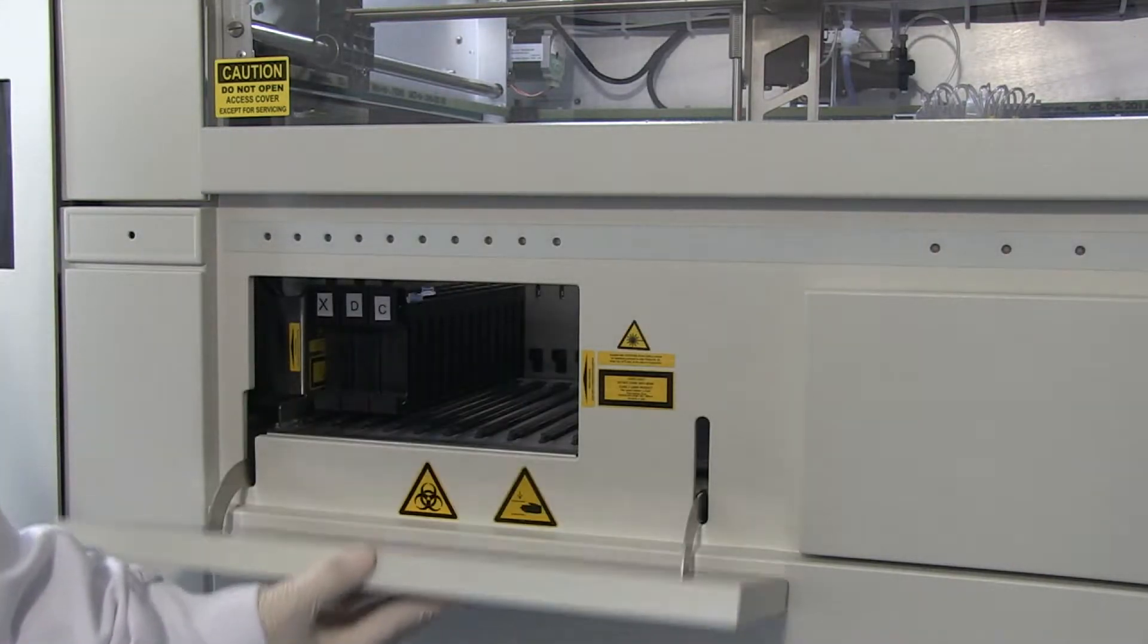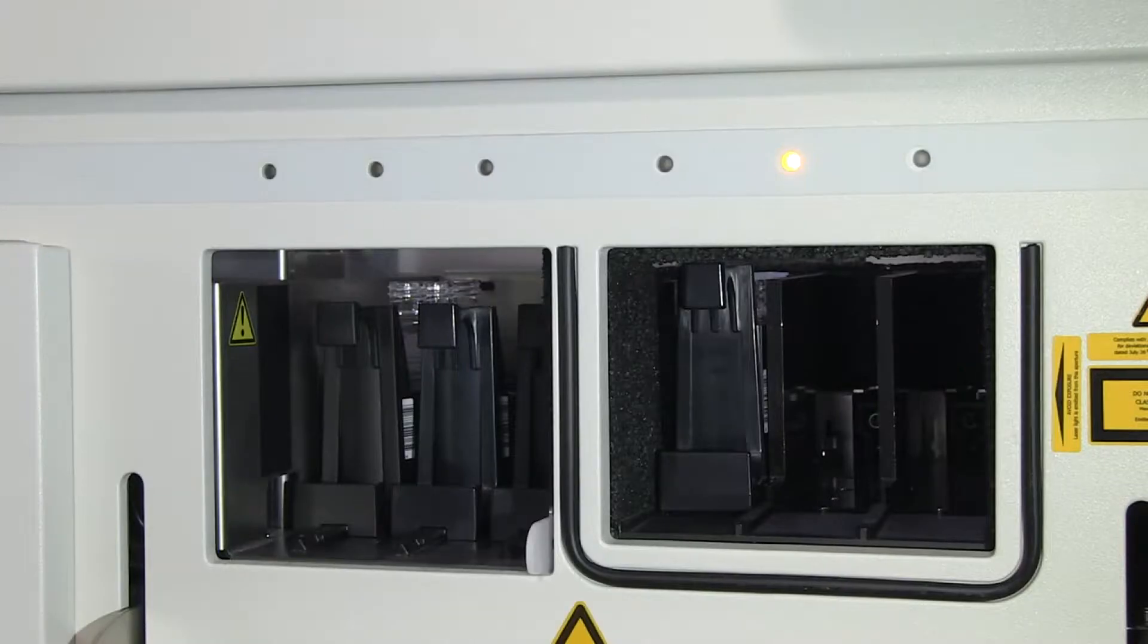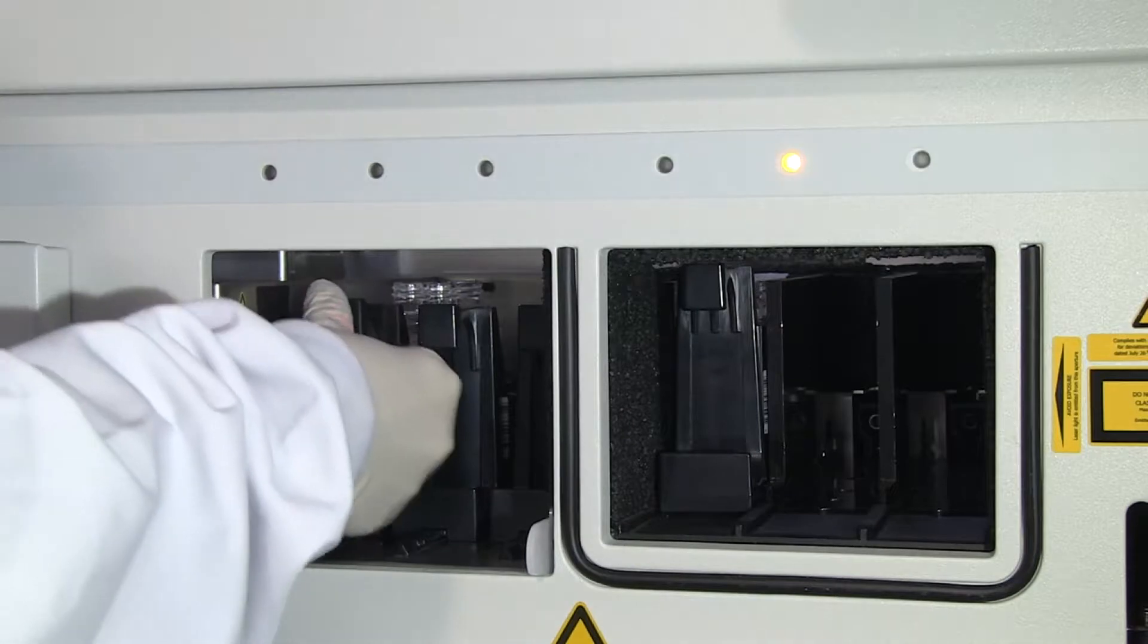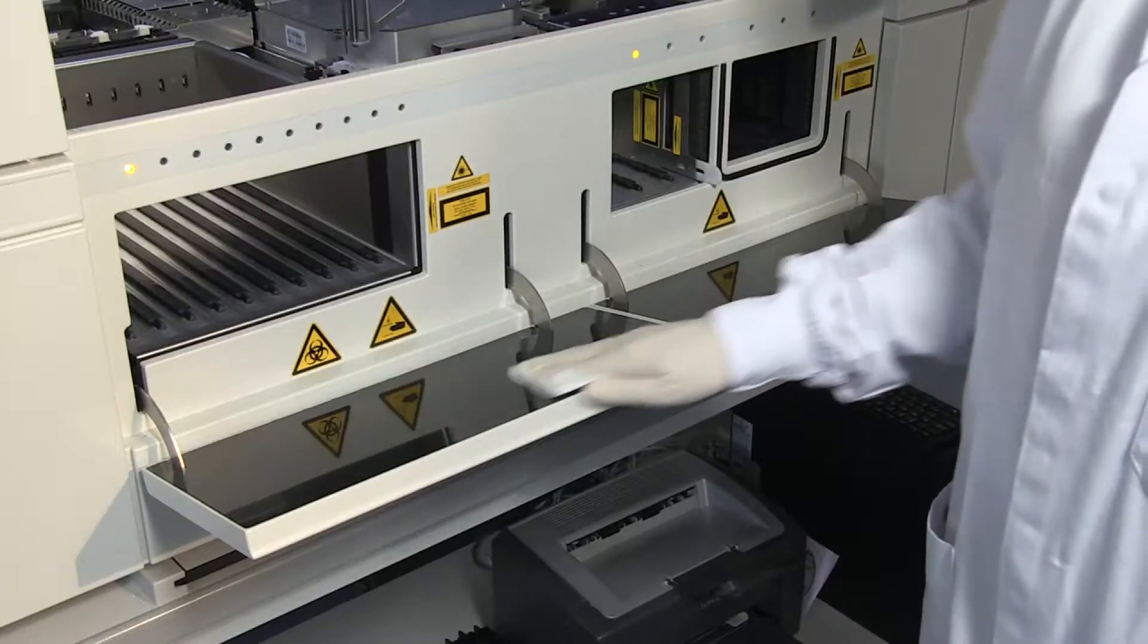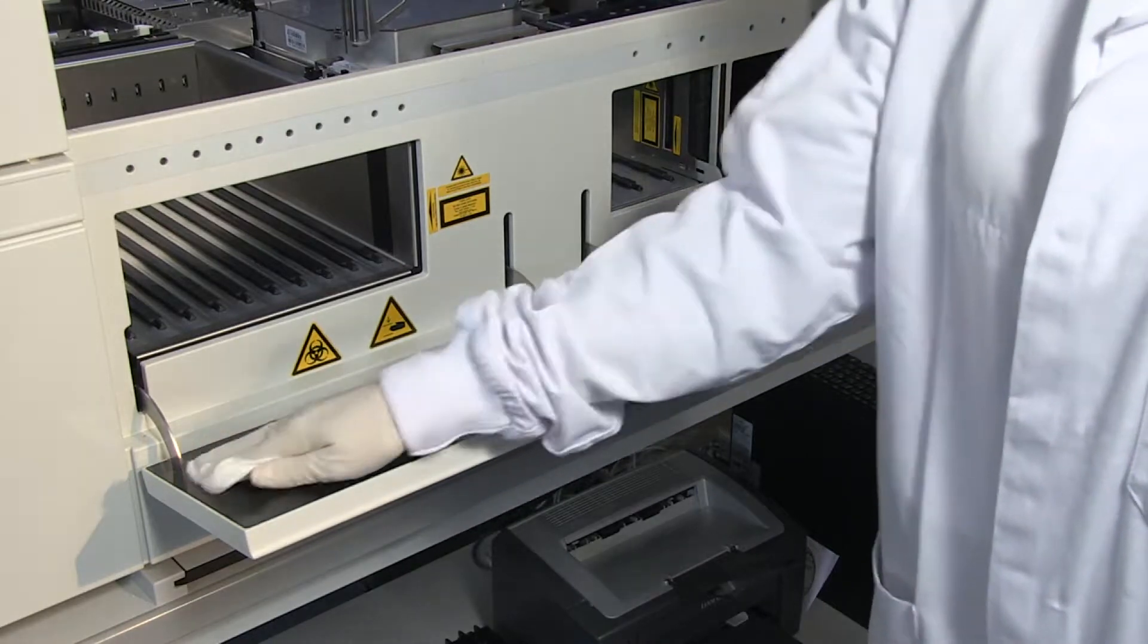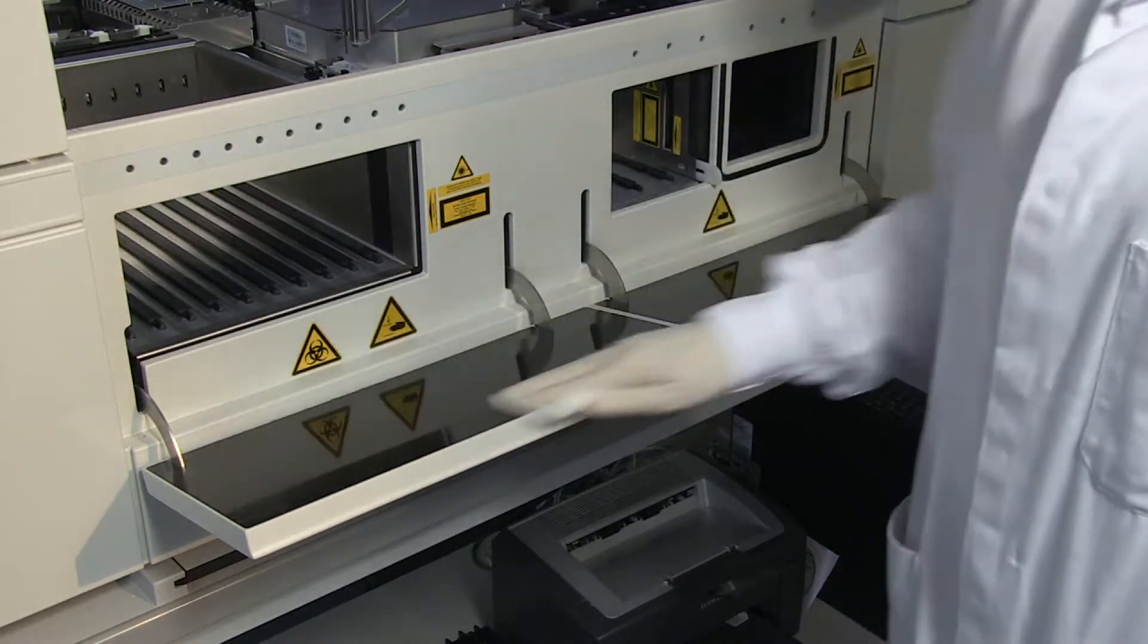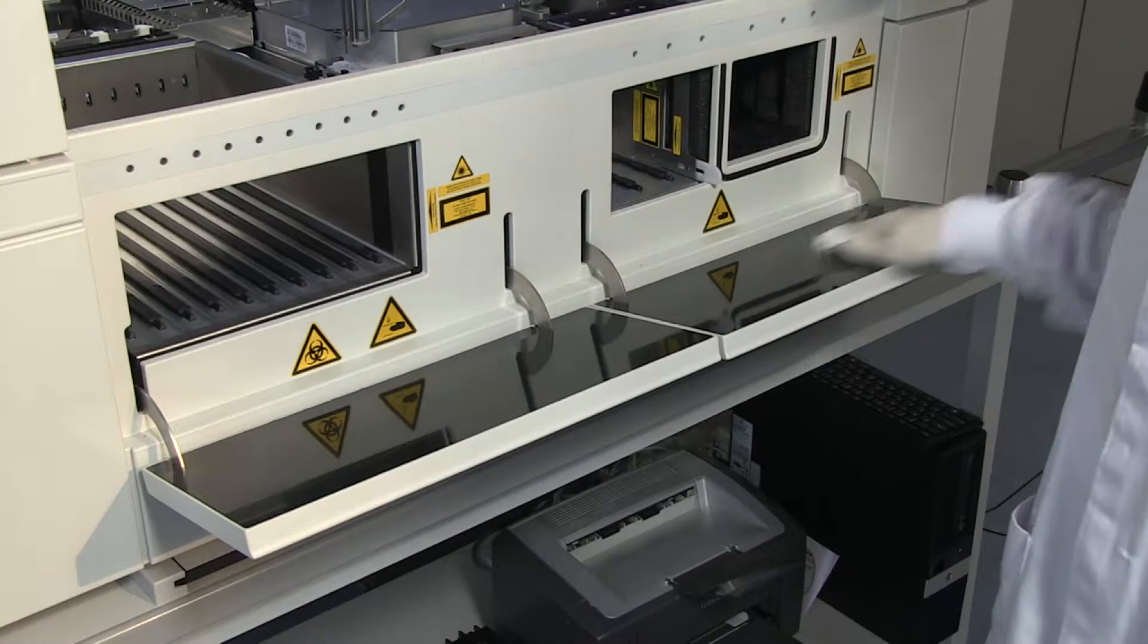Open the sample bay door and the reagent bay door. Remove all sample racks and reagent racks. Clean up any splatters and spills on the sample bay door and on the reagent bay door by wiping with water or water-based detergent.